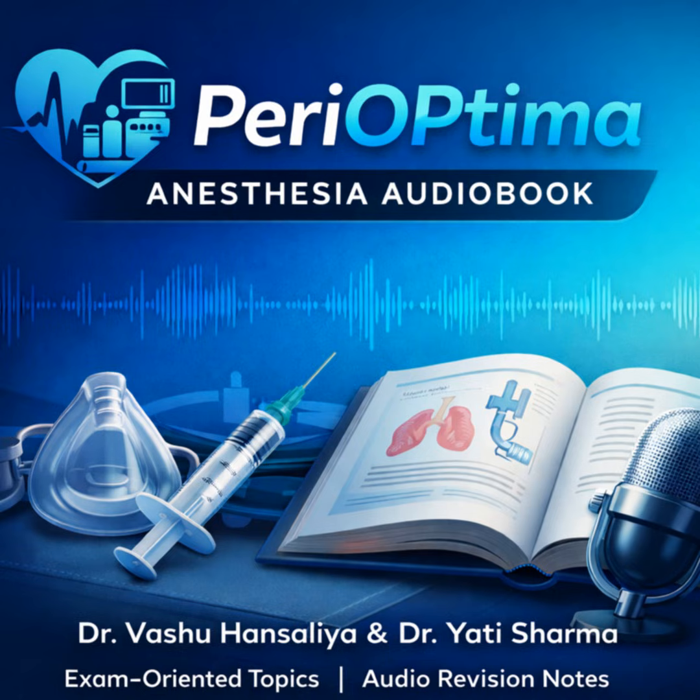Precisely. The flow of that potentially hazardous diluent gas is terminated, which prevents a catastrophic hypoxic mixture from being created further downstream. And at the same time, the alarm goes off. At the exact same time. The second device, the oxygen pressure failure alarm, is triggered, and this provides an immediate, mandatory, non-resettable auditory and visual warning, forcing the clinician to act. Forcing them to recognize the failure and immediately switch to the auxiliary oxygen supply or start manual ventilation with air.